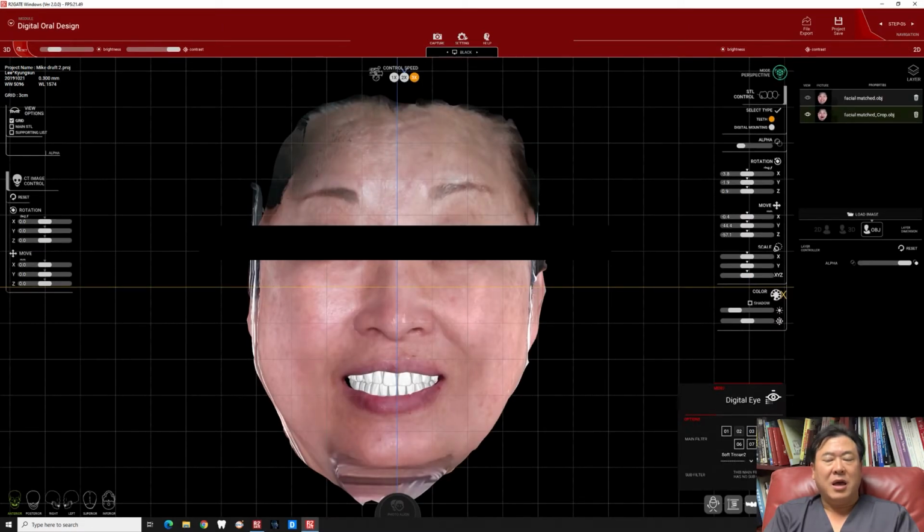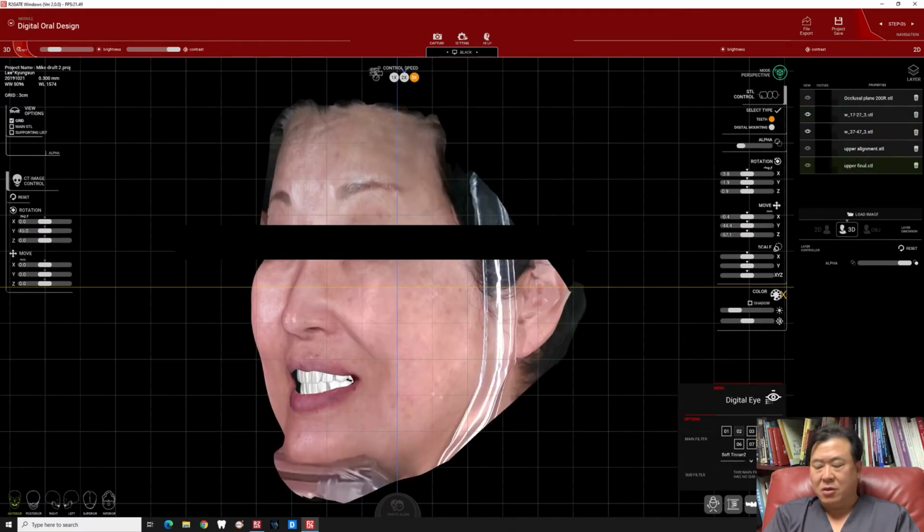Now I have the reorientation done, and I have a proper midline, the best midline derived from skeletal and facial midline. I know the ideal occlusal plane, curve of Spee, and curve of Wilson. I made a virtual wax-up of the maxilla, and this ideal wax-up was completely independent, unrelated to the existing lower teeth, which will be extracted afterwards.